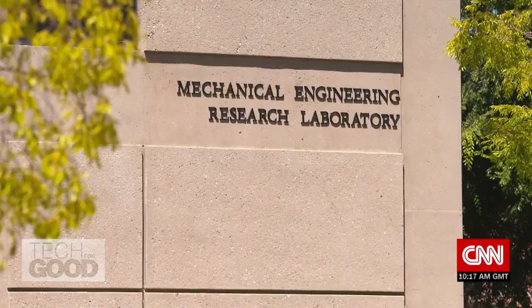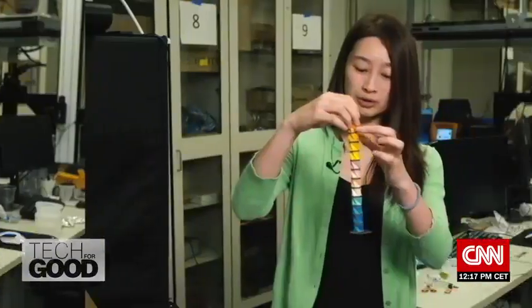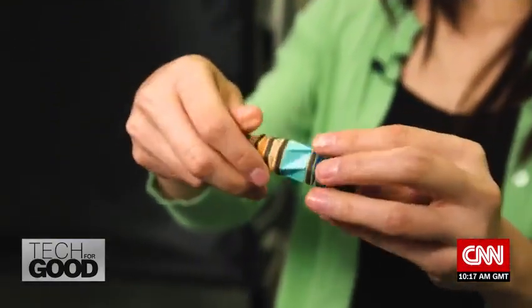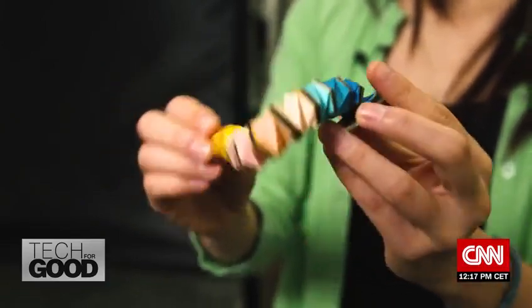Inside Stanford's Mechanical Engineering Research Laboratory, exciting innovations are taking shape. Each unit is the same origami pattern. Each of them can actually fold — it can reach out, it can contract, it can interact with objects by bending and twisting.